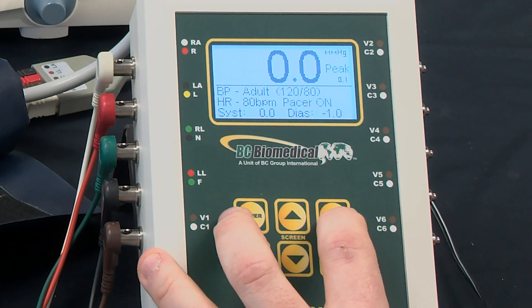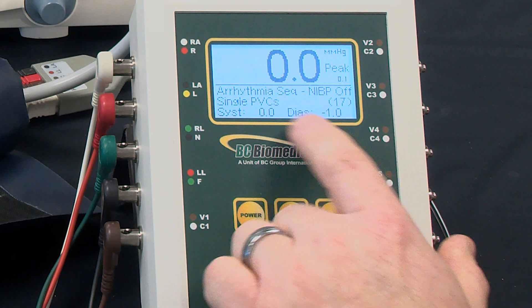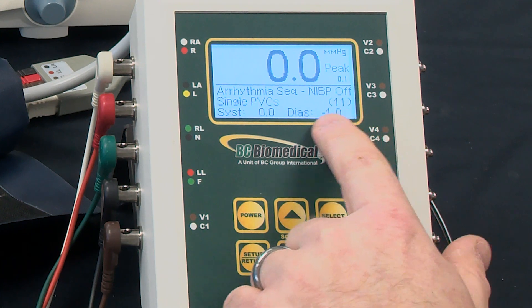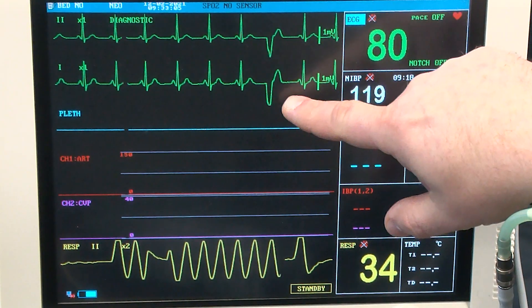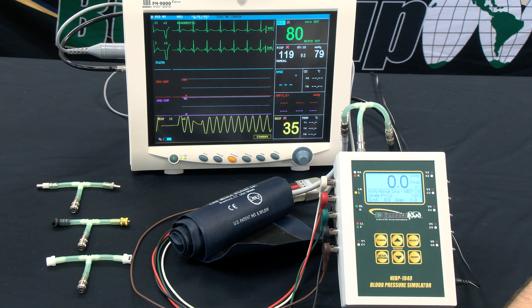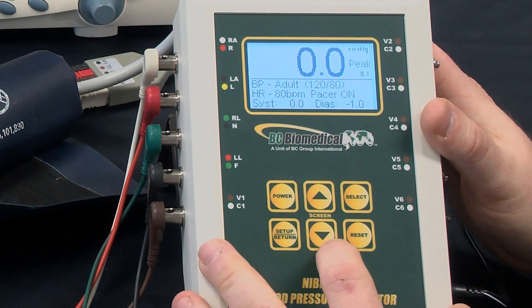If we go to arrhythmia mode, it will provide a sequence of arrhythmias and will show a timer in between each arrhythmia being displayed. We can see these arrhythmias coming out on the ECG simulation. This is an automated method for testing arrhythmias.